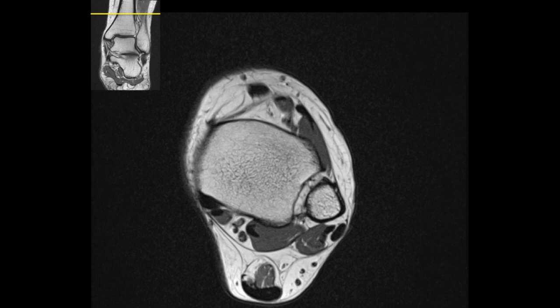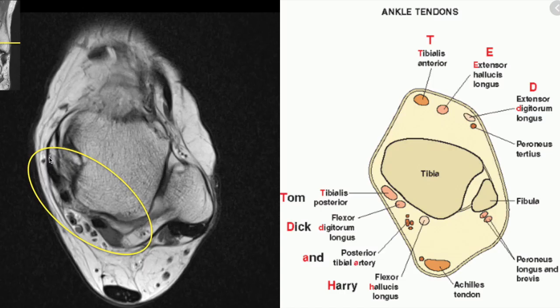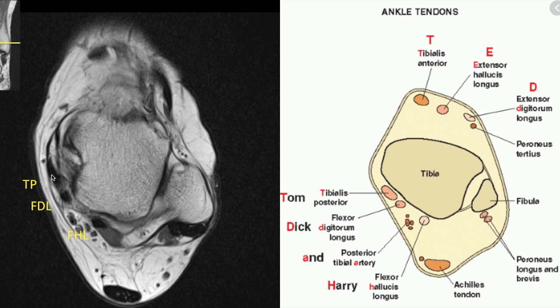Now we look at the tendons, again going from superior to inferior. The first compartment is the medial compartment, which consists of three tendons. The medial most tendon — anterior or posterior — is the tibialis tendon, so this is the tibialis posterior tendon. It is like Tom, Dick and Harry: tibialis posterior, then flexor digitorum longus, then flexor hallucis longus. Between these two tendons you have the posterior neurovascular bundle.